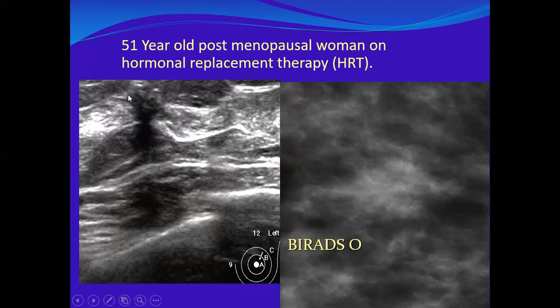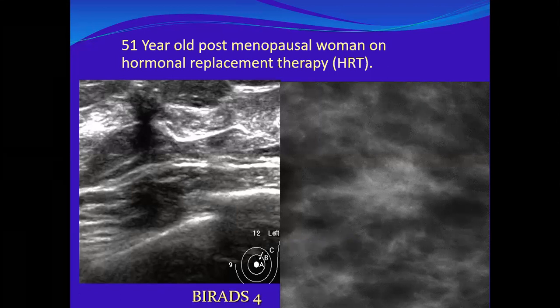Okay. And this, you see, it is going here, extending beyond this area, but not definite. Yes, spiculated, yes. Vertically oriented, yes, but no definite cutting signs. Still, it is BI-RADS 4C. It's suspicious, and the diagnosis was a radial scar.